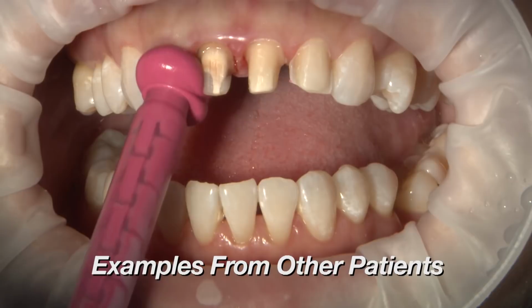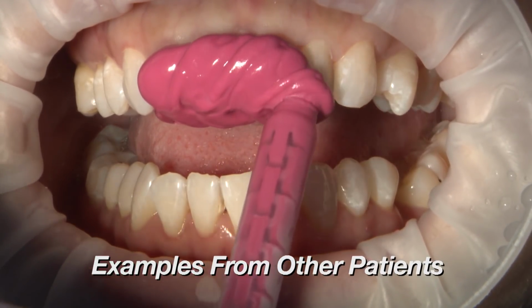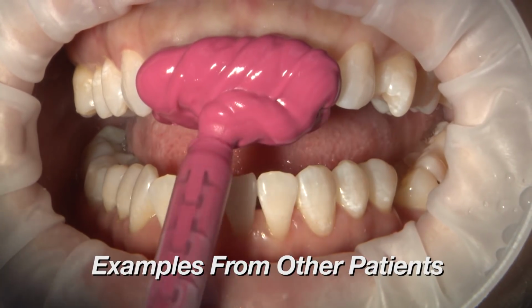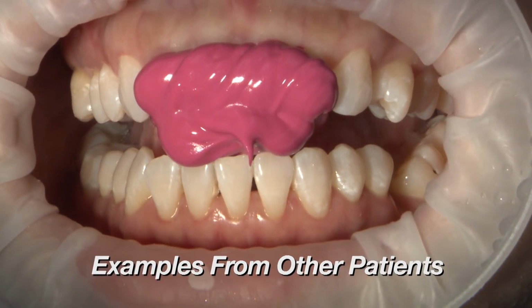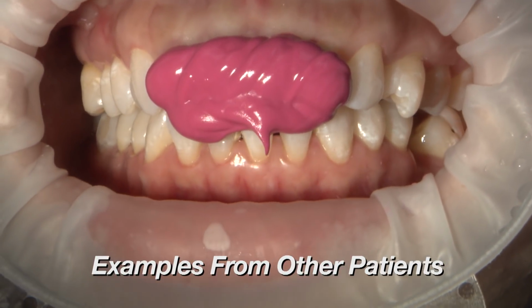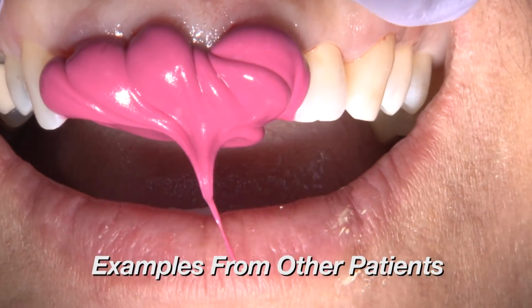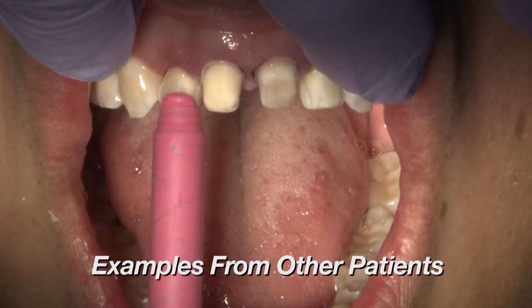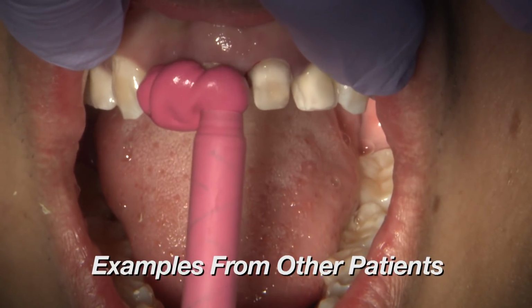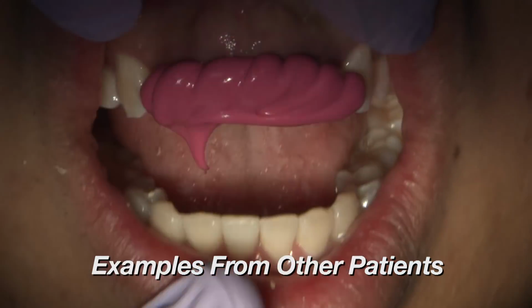When I capture a bite record for a limited number of restorations and have not used a triple tray, I only extrude the silicone over the teeth that have been prepped and then have the patient bite together until all other teeth are in occlusion. This way, I know that my bite record will provide the lab with the correct vertical dimension of occlusion. Additionally, if I don't guide the patient to close on the back teeth, then the patient will naturally seek contact on the anterior teeth by sliding the mandible into a more forward position.